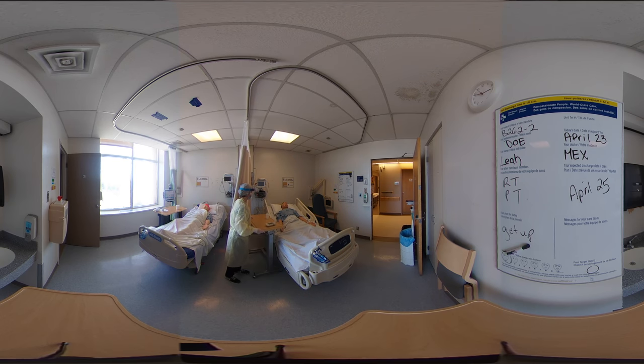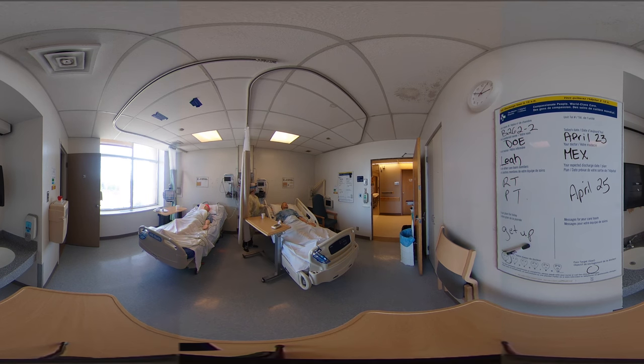Do you mind if I do your vital signs? That sounds like a great idea. I'll put the sat probe on your finger there. I'll scan your bracelet. So I noticed your sats are 94%. I'm going to try and turn your oxygen from 4 liters down to 3 liters, and we're going to leave the probe on to make sure that you stay above 92%. I'll check back on that.